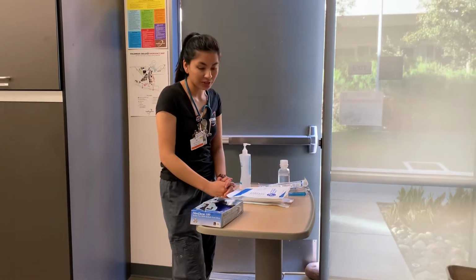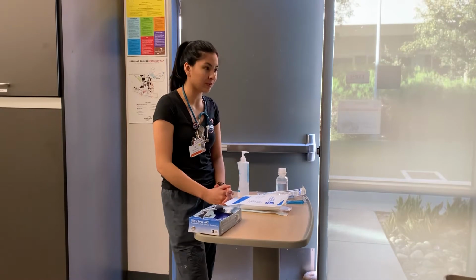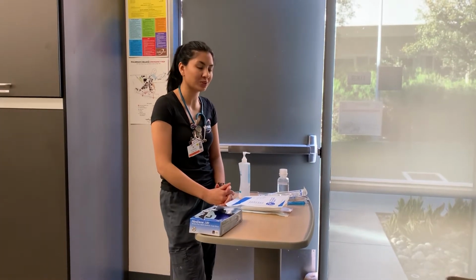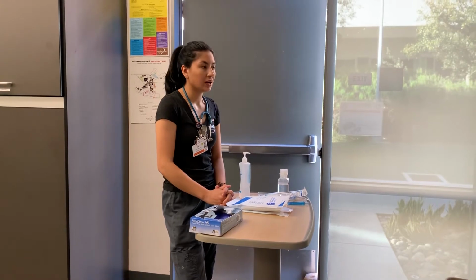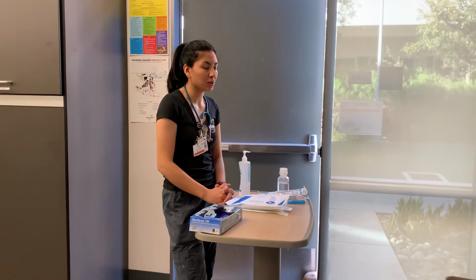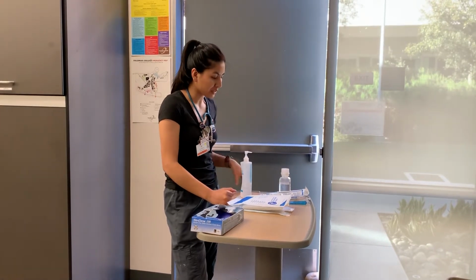So the first thing I'm going to do is check my doctor's orders, make sure I have the right patient. I have Jane Tripp, 567-324009. I'm going to check the orders and see that it is time for me to do suctioning for Jane's trach, and it is. Before I go in the room, I'm going to gather my supplies.